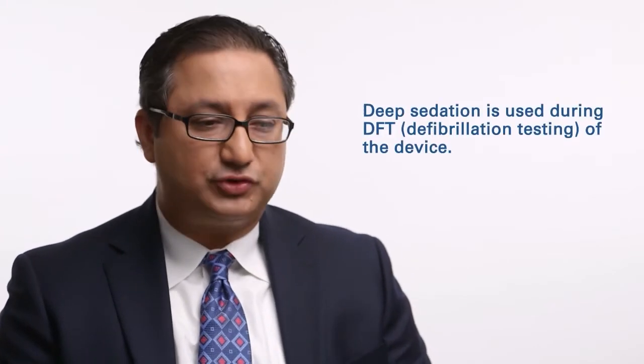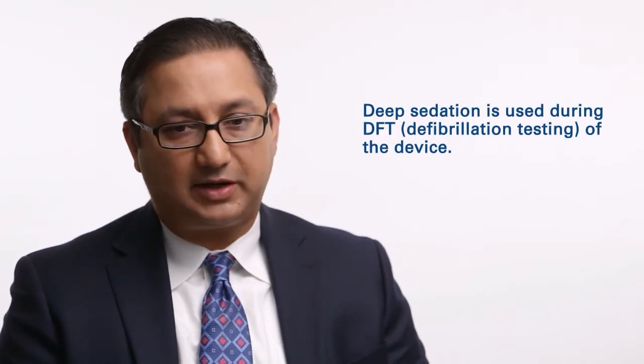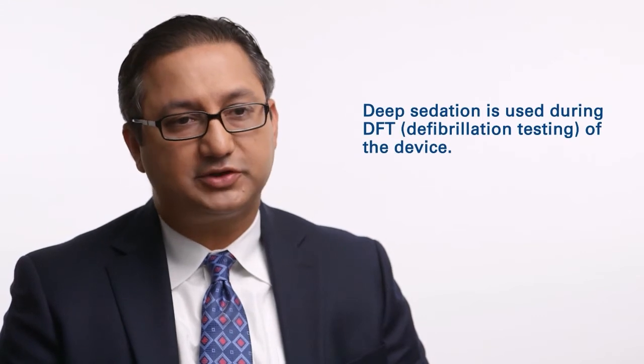We tend to use deep sedation for the times in the procedure where there may be additional pain or more pain than normal. And then, of course, during DFT testing, but it's very possible to do the procedure with moderate sedation alone.